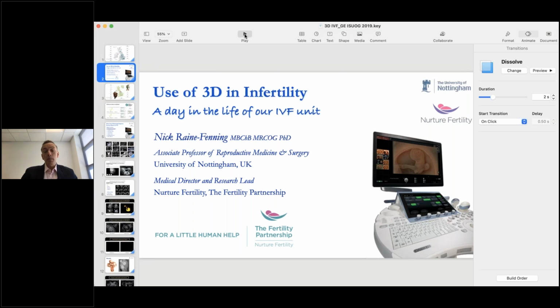But what we also know is a lot of these women have poor quality eggs. None of this you can tell really just from blood tests and from looking at the clinical phenotype. This is where ultrasound really comes into its own. So we've got to pick up pathology, maybe not necessarily worry about it, but we need to be advising patients accordingly. Sometimes there'll be surgical intervention, and sometimes there'll just be reassurance. And I'll give you a few examples.